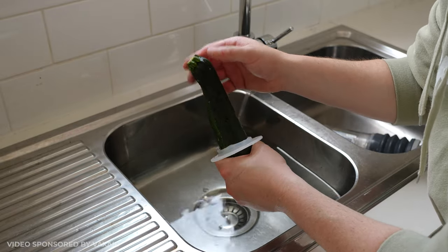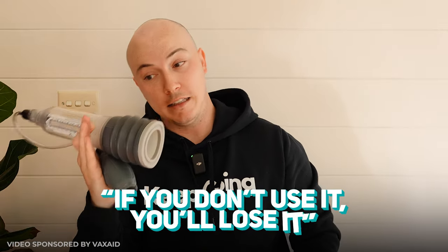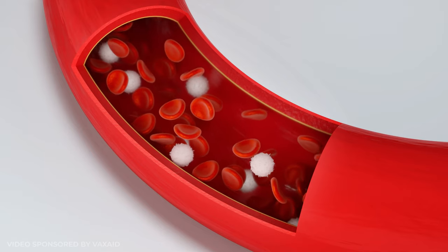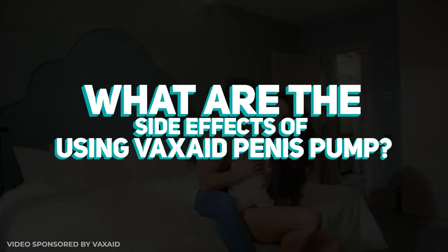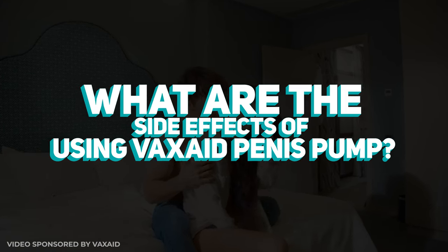If you're not delivering blood flow to your penile tissue and not stimulating your penis and giving it a good workout every now and then, the old saying 'if you don't use it, you lose it' applies here — and none of you want that. This device, the Vax Aid Deluxe, delivers fresh oxygenated blood to your penis and traps it there, allowing you to retrain your erections and be intimate with yourself or your partner.